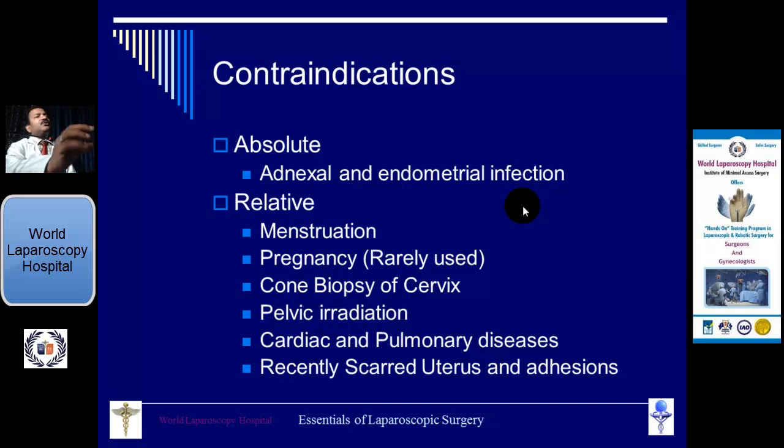Otherwise you are going to push all the infection through the fimbrial end into the abdominal cavity, and if you have not combined it with laparoscopy, you will not be able to clean it, and then it can exacerbate the PID, and there may be peritonitis. So in an infective state it is better to avoid it.